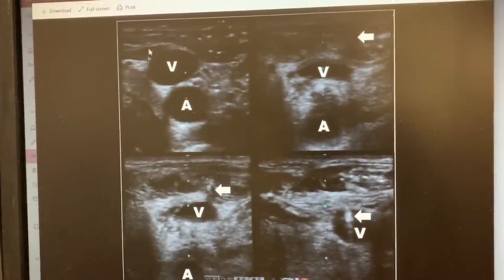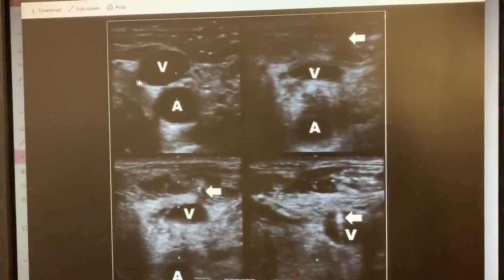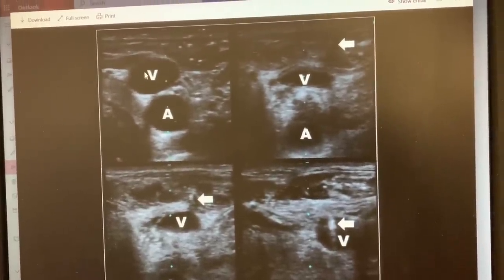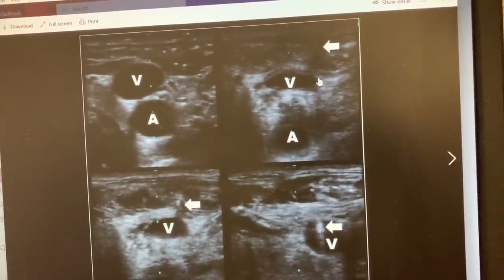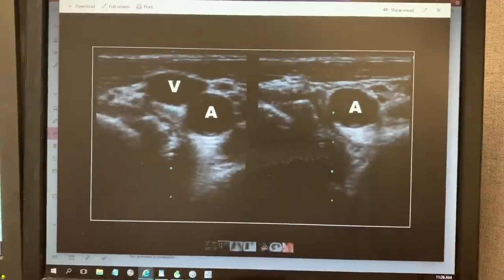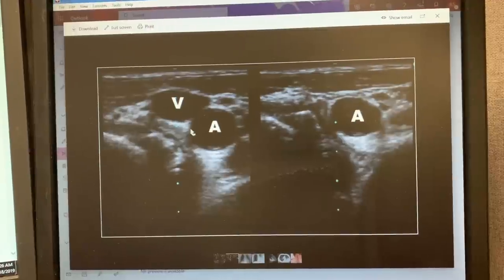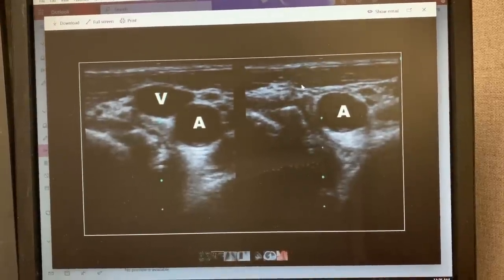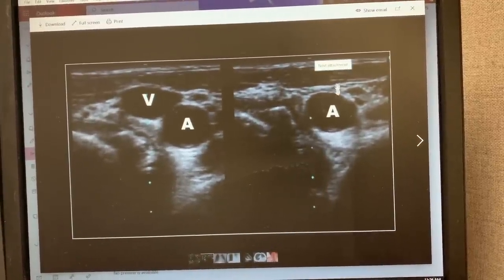What you're looking at here — without anything — this is the internal jugular vein, and it's a little bigger; usually it'll be bigger than the artery. This is the carotid artery. So when you put in a central line, you want to go into the vein. What this is showing is that the vein is compressible, because the walls of the vein allow it to be very compressible.